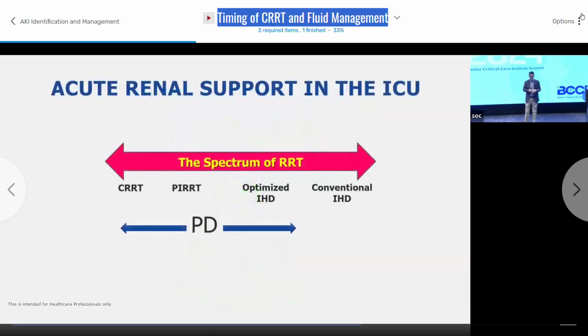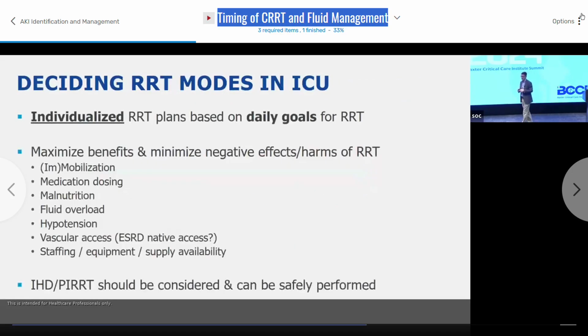Everyone has to communicate. Dialysis is a spectrum. You've already heard this from Dr. Goldstein. I like to differentiate between conventional outpatient hemodialysis and tailored optimized hemodialysis in the hospital. Most patients in the ICU are not going to tolerate outpatient dialysis settings, so don't prescribe it that way. And then what about PD? So we need to individualize our plans based on our goal.